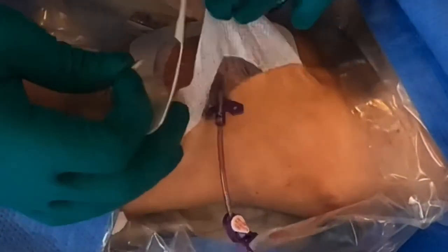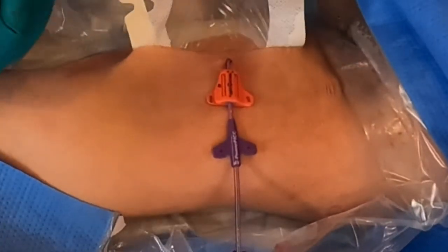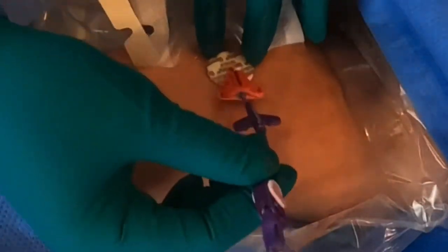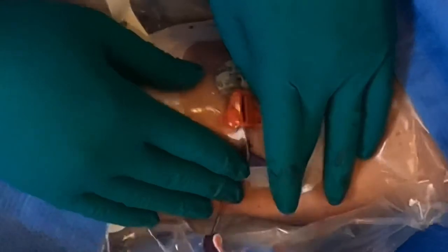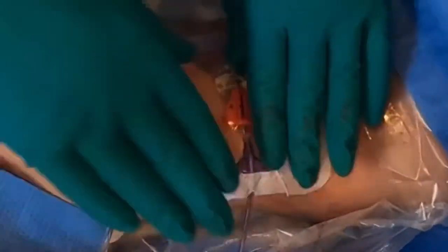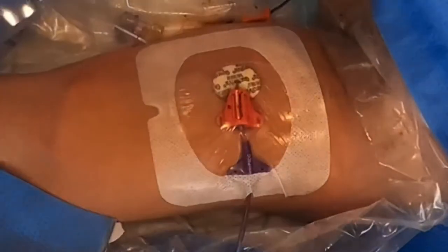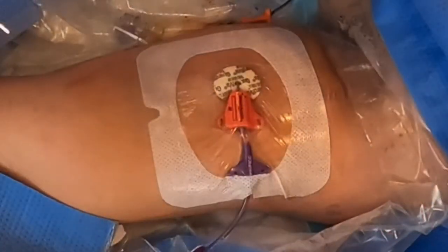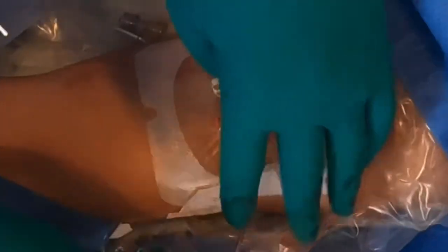I forgot this — got too excited. Good thing we put the gum mastic on there. This slit needs to go in with the secure cath. Let's see how well that gum mastic tackifies on here. That's beautiful — look at that. Even with slight disruption it still held on pretty well. We'll see. If this starts to come off earlier than seven days — when we're going to change it — just give us a call, we'll come out and change it sooner, because infection happens when the dressing is coming off. And of course, date and time.